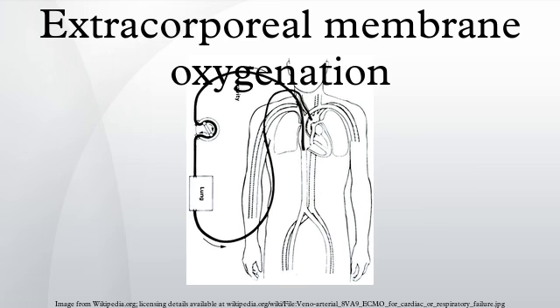The survival rates reported are better than historical survival rates. In the United Kingdom, respiratory ECMO is concentrated in designated ECMO centres to ensure top-quality care. Cardiac failure. Veno-arterial ECMO is a bridge to further therapy, either a ventricular assist device, transplant or recovery.